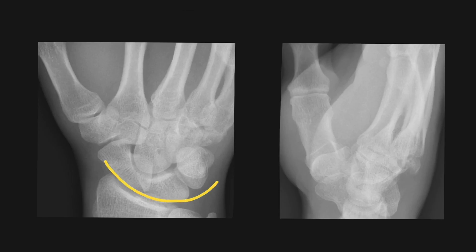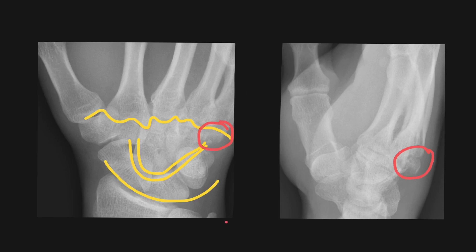On this lateral and oblique view of the wrist, when we draw the carpal arcs they seem in line, however there seems to be an abnormality at the region of the hamate, and the lateral confirms a hamate fracture.